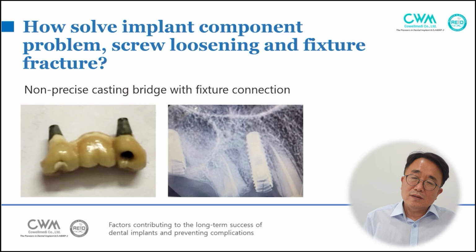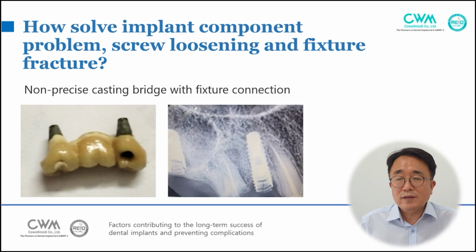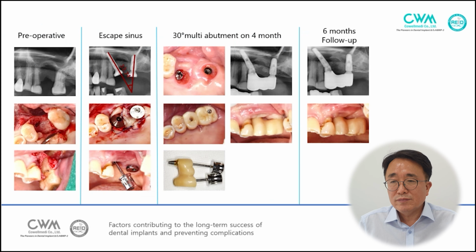Some dentists use a direct casting metal framework. So this non-precious metal bridge with a fixture connection is very dangerous. So we have to use the multi-unit abutment.